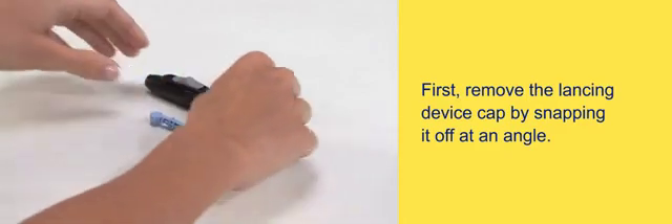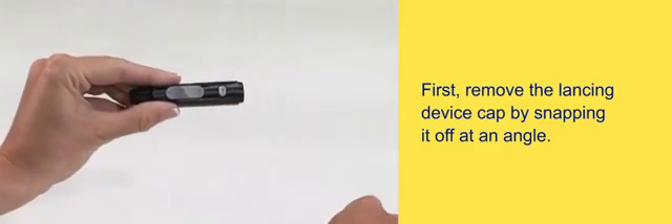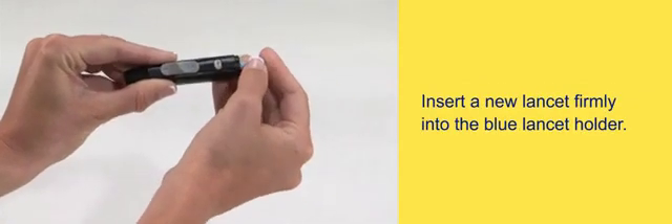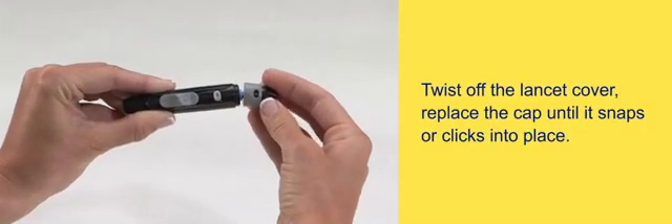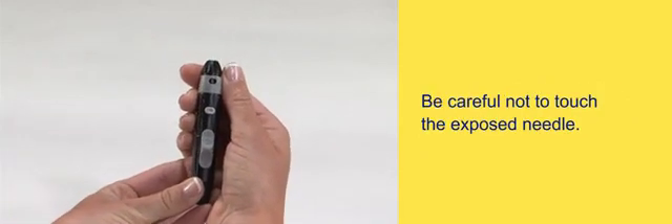First, remove the lancing device cap by snapping it off at an angle. Insert a new lancet firmly into the blue lancet holder. Twist off the lancet cover. Replace the cap until it snaps or clicks into place. Be careful not to touch the exposed needle.